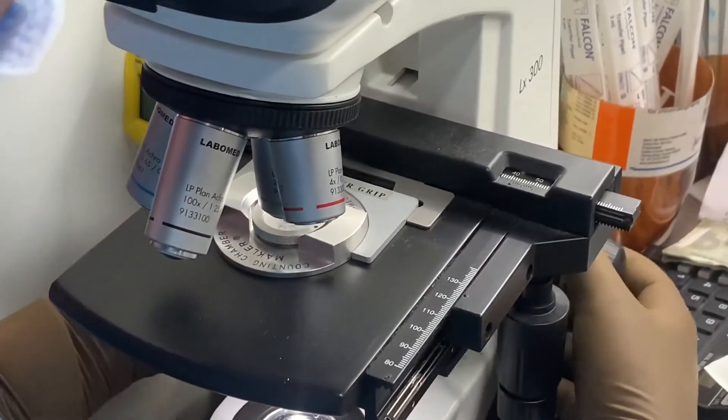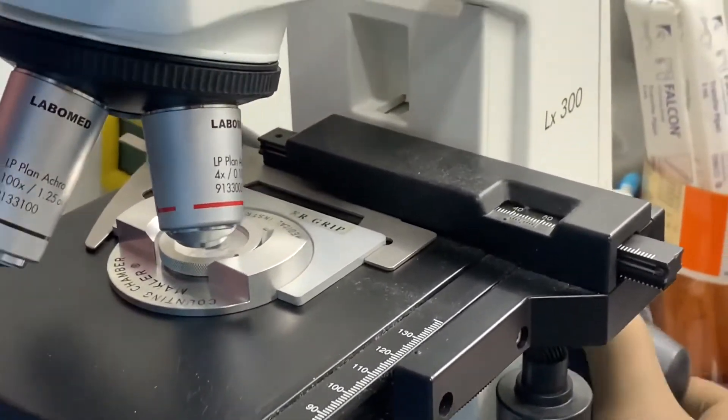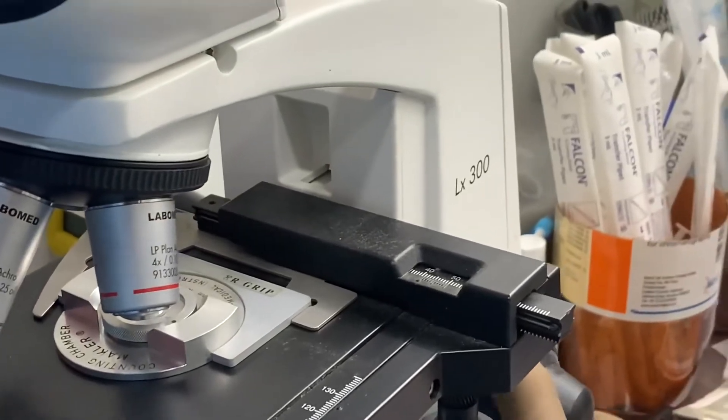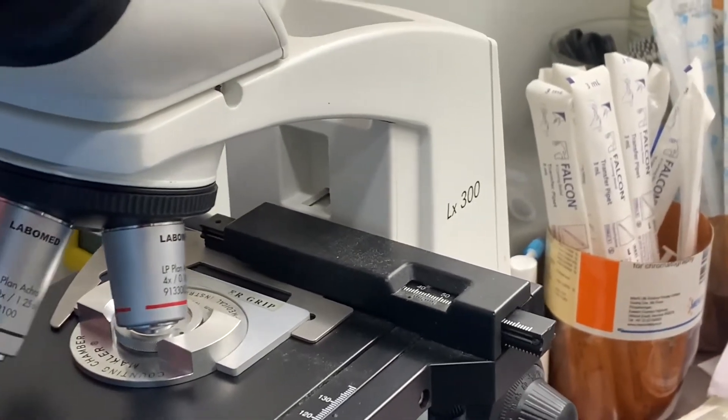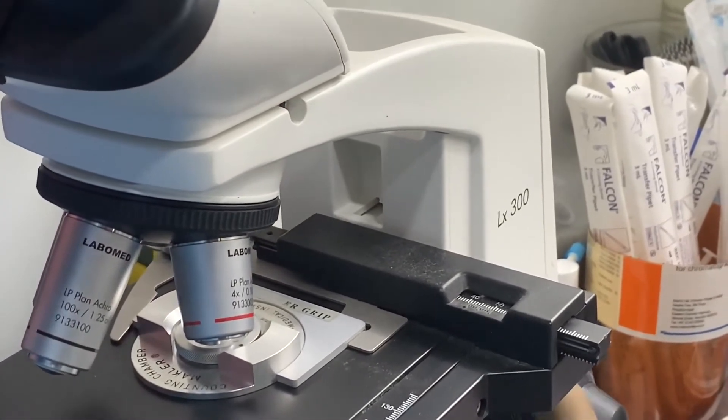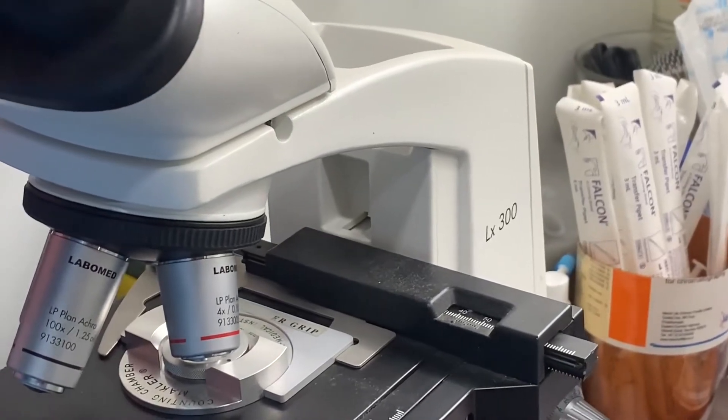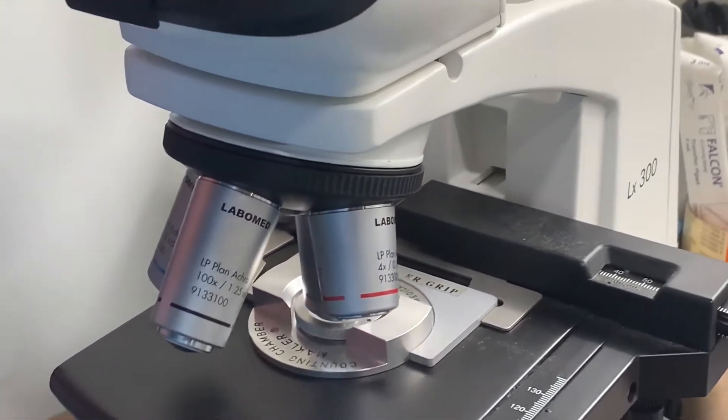Then that to be seen under microscope. Whether proper number of sperm is there or not, that to be noted. How many motile sperm? A-grade, B-grade and non-motile sperm.